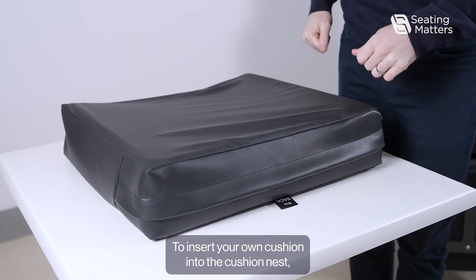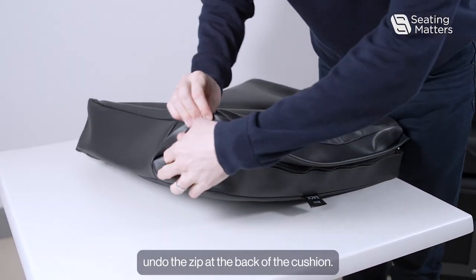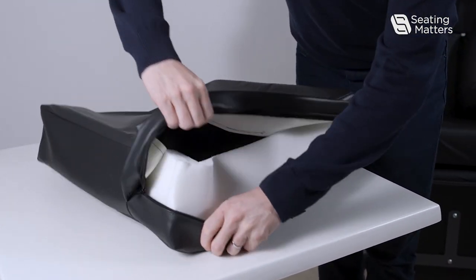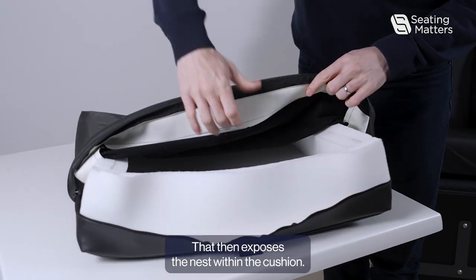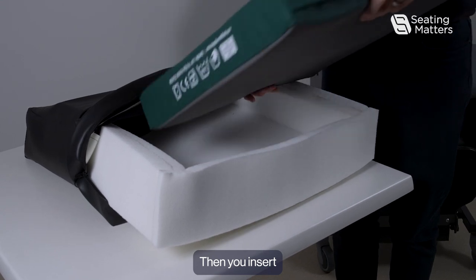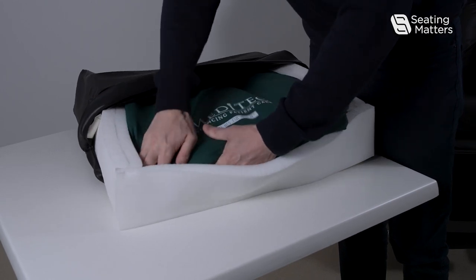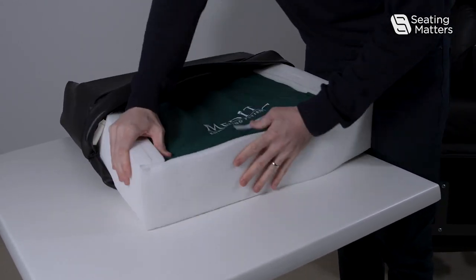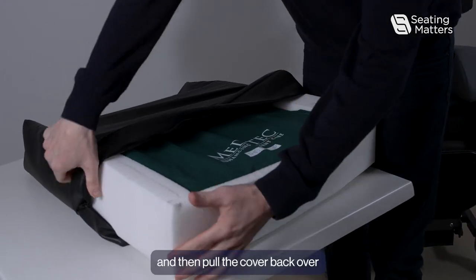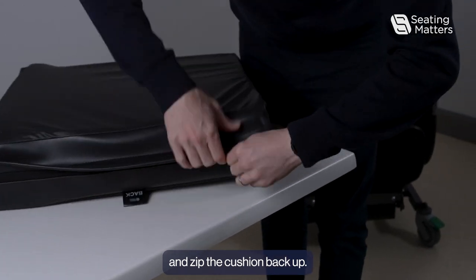To insert your own cushion into the Cushion Nest, first undo the zip at the back of the cushion. That then exposes the Nest within the cushion. Then insert the patient's cushion into the Nest, pull the cover back over, and zip the cushion back up.